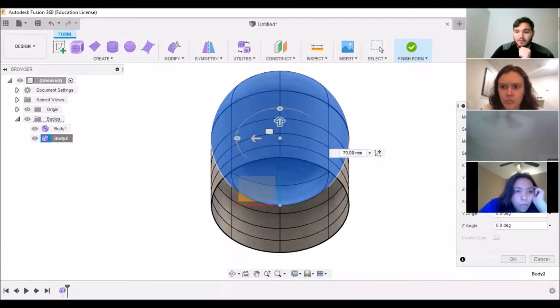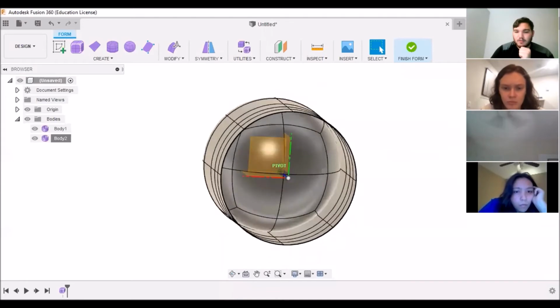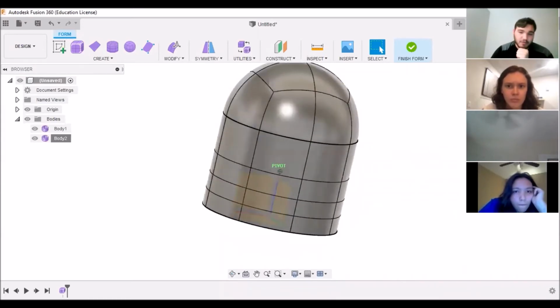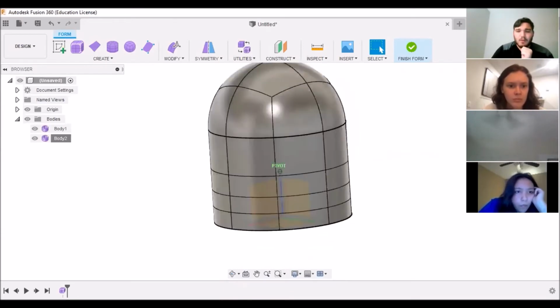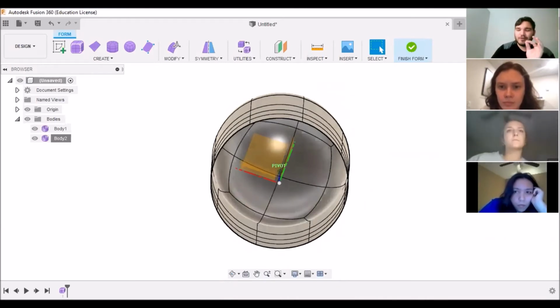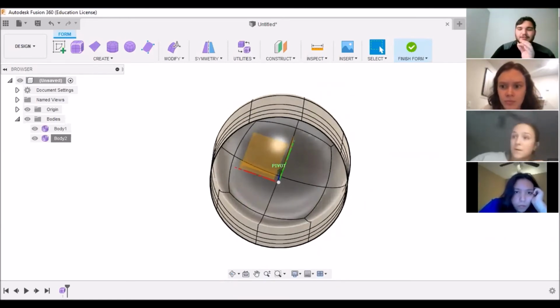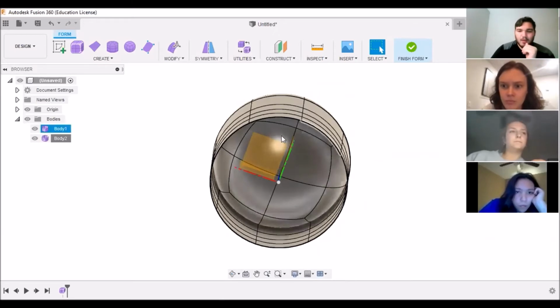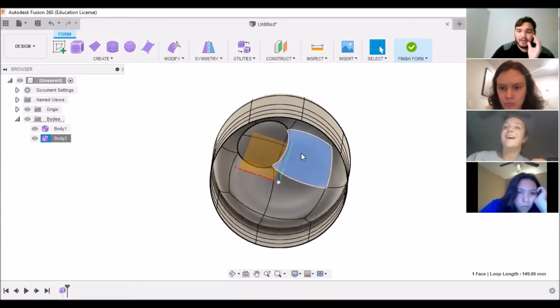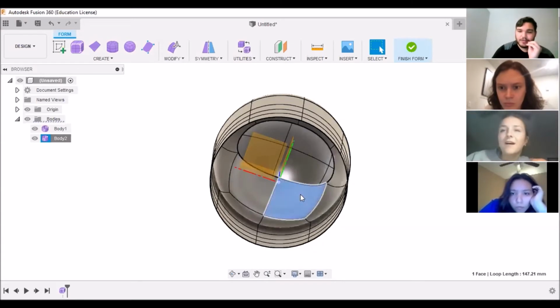And once you're happy with where you've moved it, you can press OK. And now we have something similar to what we had before. I'm just going to show briefly what you can do to save time, but just assume that you can do this for the rest of the ball. If you want to take away specific faces, so let's say we want to hollow out this as well, you can just delete the face. So highlight a face, press delete, and all these faces slowly go away.